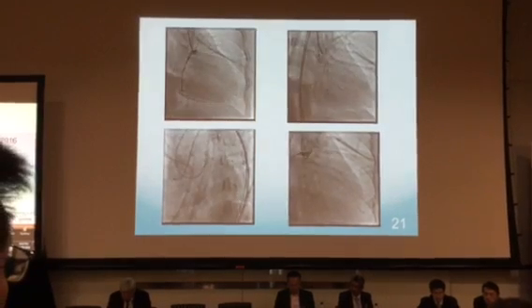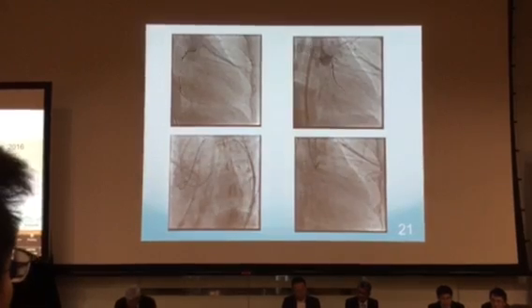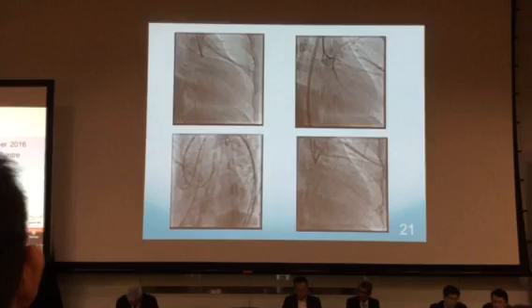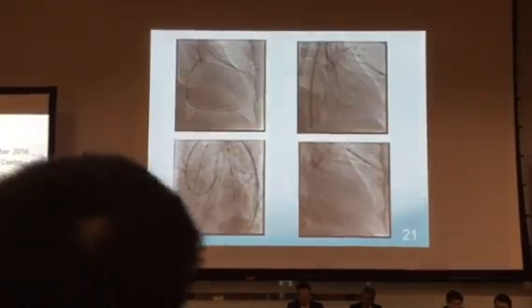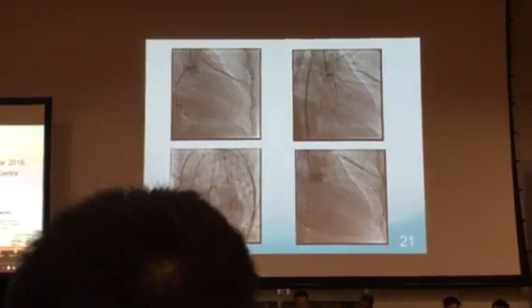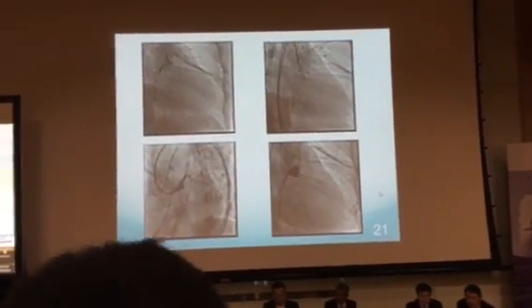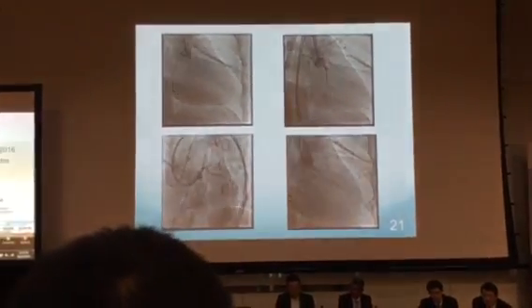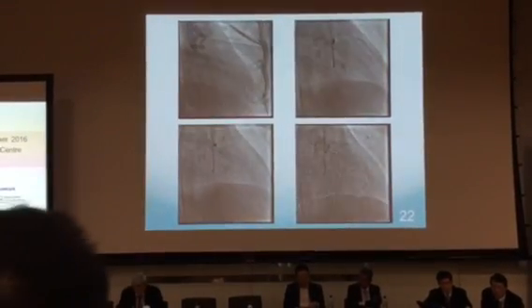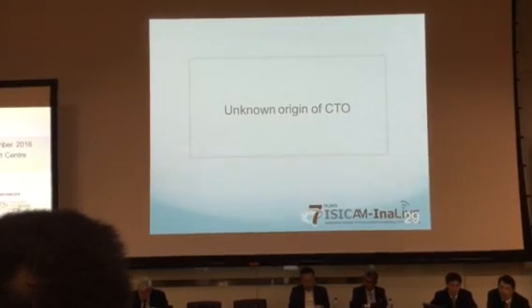But even using just a soft hydrophilic wire backed up with a microcatheter, this lesion can be crossed by a Runthrough Hypercoat supported only by a microcatheter, without using a stiff wire. And I love to use my finger to twist the wire without a torquer. The next step is ballooning and stenting.